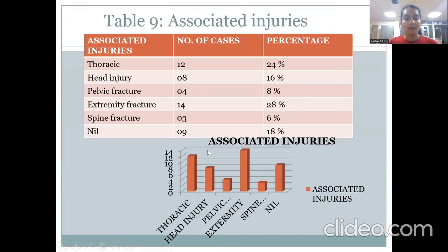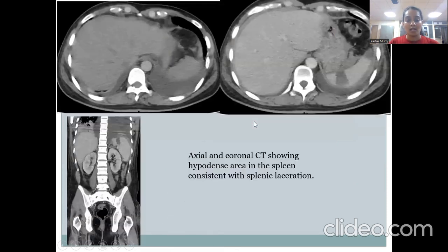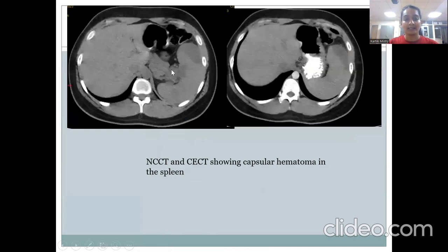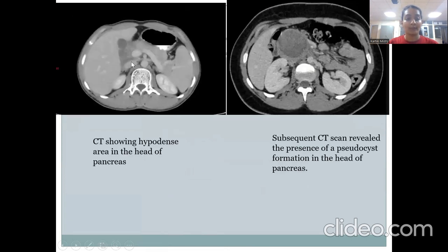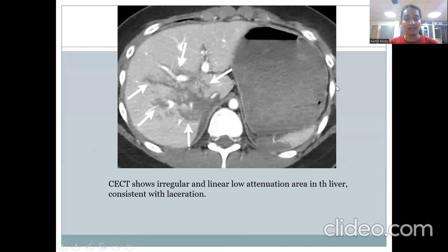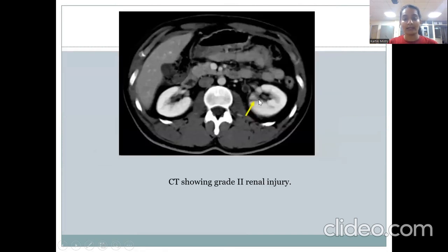Associated injuries were also noted; the most common were extremity injuries, followed by thoracic injuries. CT imaging examples shown include: axial and coronal CT demonstrating hypodense areas in the spleen consistent with splenic laceration; NCCT and CECT showing capsular hematoma in the spleen; CT showing a hypodense area in the head of the pancreas with subsequent pseudocyst formation; CECT showing irregular linear low-attenuating areas in the liver consistent with lacerations; and CT showing a grade 2 renal injury.